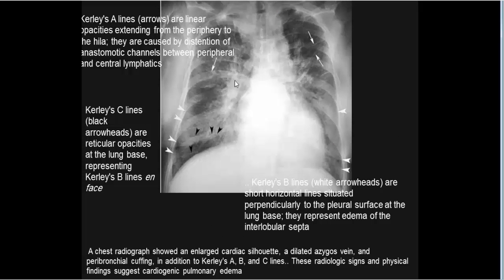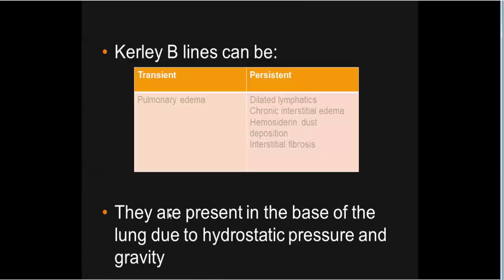Kerley A lines radiate from the hilum toward the periphery, representing deep septal lines in the central portion of the lung that do not reach the pleura. Their presence normally indicates a more acute or severe degree of edema. Kerley B lines appear peripherally, perpendicular to the pleural surface. Kerley C lines appear as a spider-web or interlacing superimposition of B lines. Kerley B lines may be transient or permanent, seen in pulmonary edema, dilated lymphatics, interstitial edema, and interstitial fibrosis if persistent.